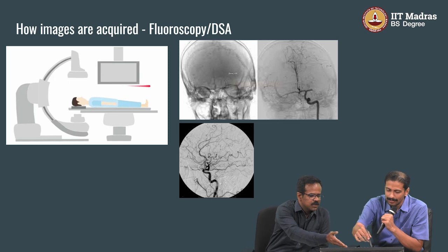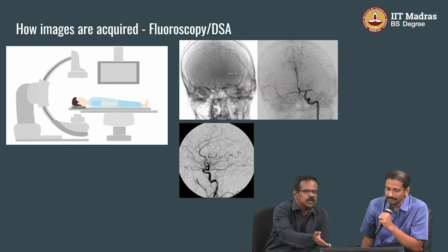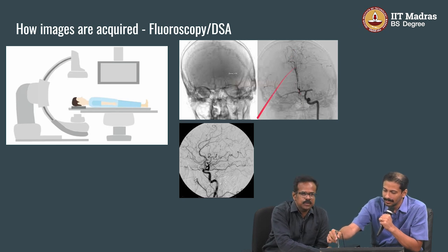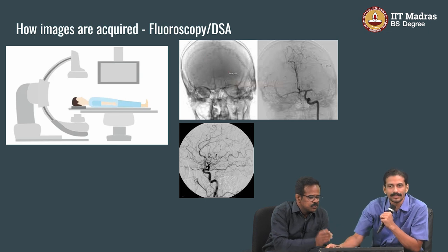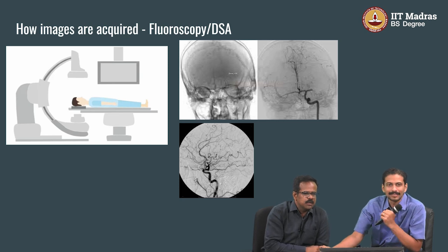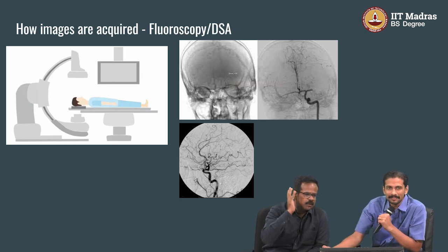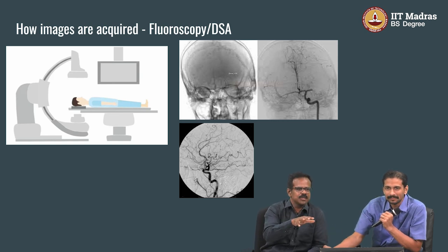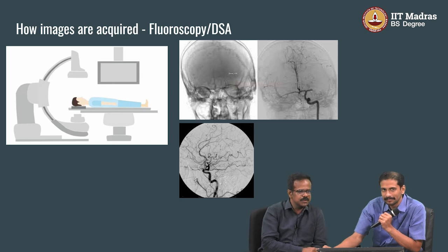This is inside the brain, how your vessels look. He has shown an image where one vessel has got a block. These are our angiogram images. So this is how a fluoroscopy will look. The previous was his day-to-day work. This is my day-to-day work, seeing inside the head, how the vessels go inside. And if there is a block, doing some plumbing work or sealing work. This is our job. But the first essential step is to see them. The technology has enabled these things.